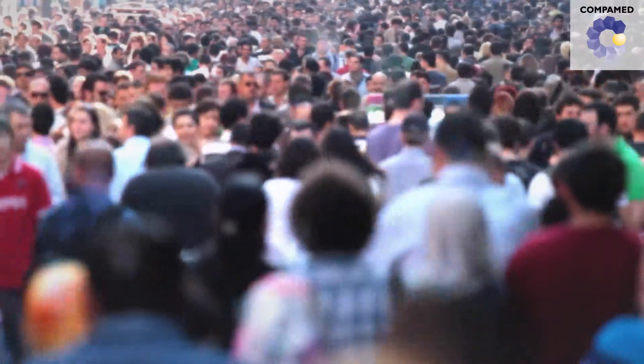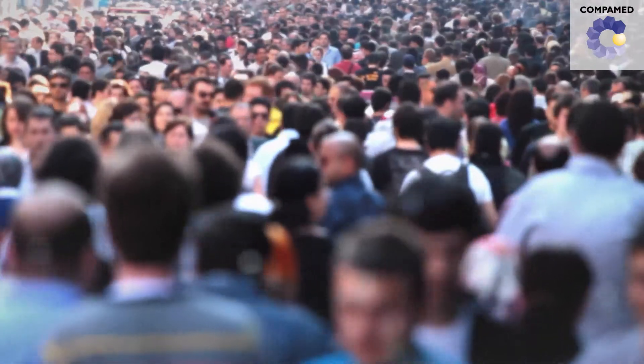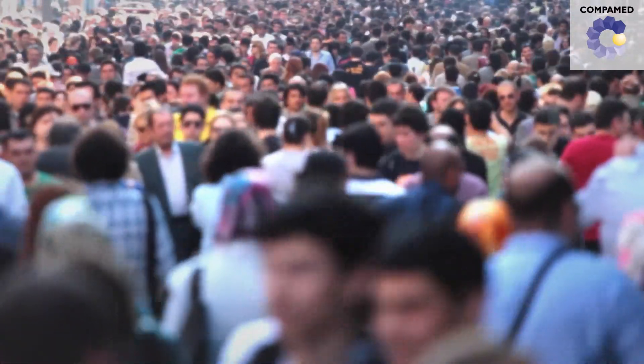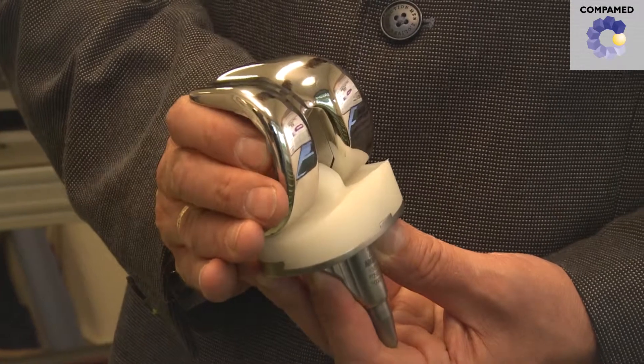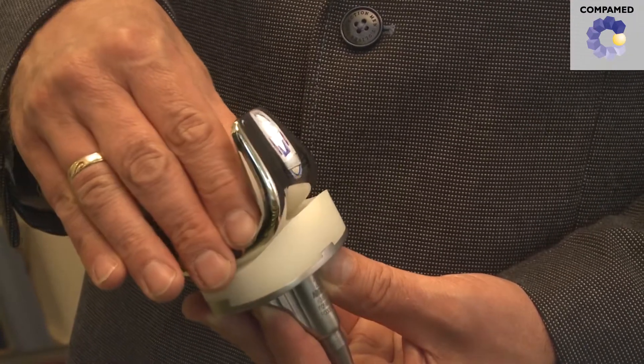On average, about 40,000 kilometers — this is how far every person is estimated to walk during his or her lifetime. Our knees bear the brunt of every one of these steps. Prosthetic knees need to be able to bear the same load. They are made from metal components and plastic inlays which can quickly wear out, and this can result in their loosening.